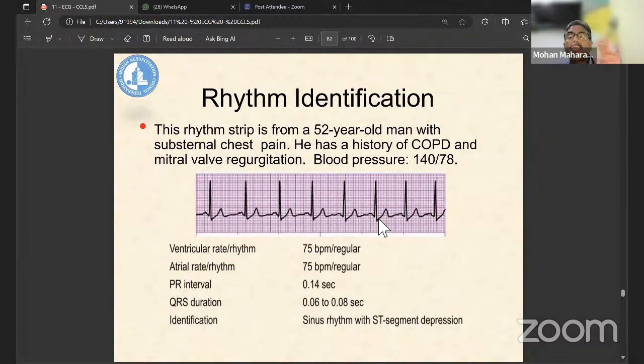Please understand a few points here. Whenever there is an ST segment depression, if it is going upward with concavity, that means it's not ischemia. If there's no concavity, then it is a risk of ischemia. Everywhere look at this concavity. We send for the 2D echo, that is a different issue. But whether the ST depression is convex, whether it has a straight upward or downward slope, all these things are because of ischemia. Please remember that.